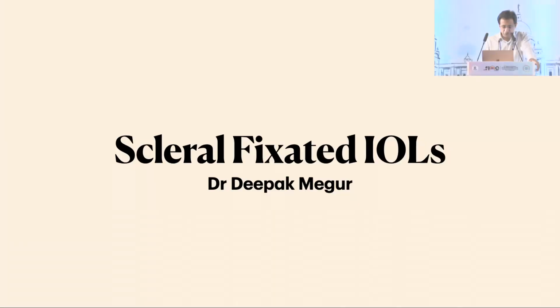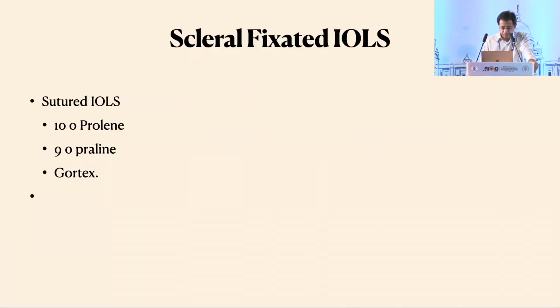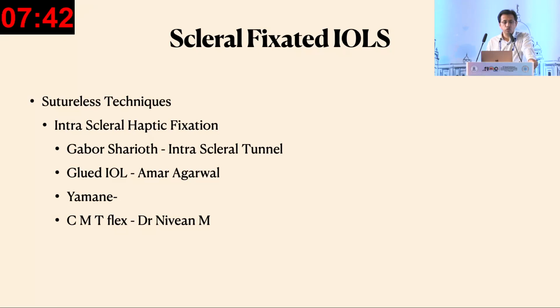I'll be giving a basic overview of the scleral fixated lenses and trying to share a few tips here. I think the scleral fixated IOL techniques can be divided into two major groups. The one where we suture the haptics to the sclera, where the haptics are fixed to the sclera by using a suture, and the second would be a sutureless technique. In the suture technique, we were using 10-0 Prolene before. Now we've shifted to 9-0 Prolene, and nowadays we are shifting to Gore-Tex.